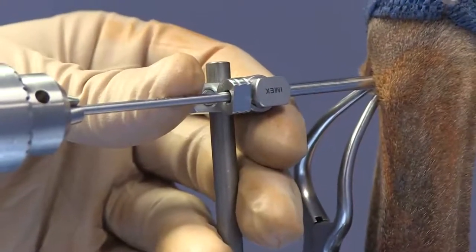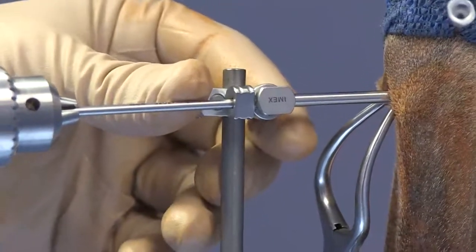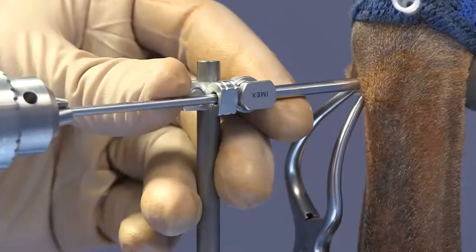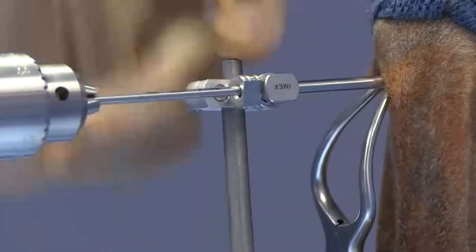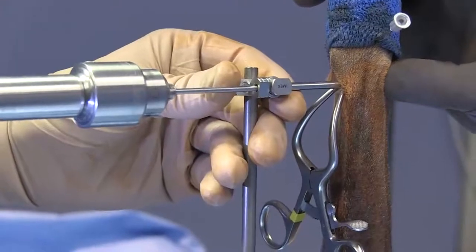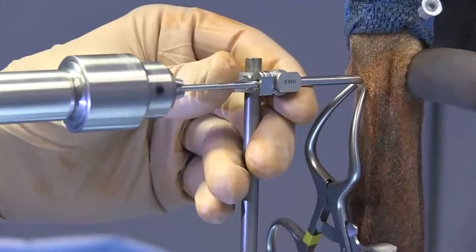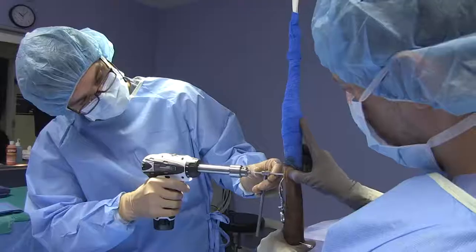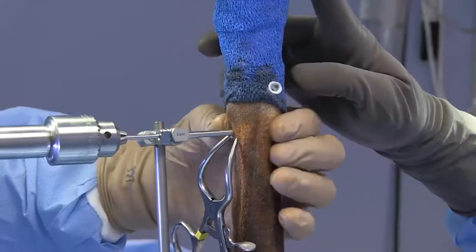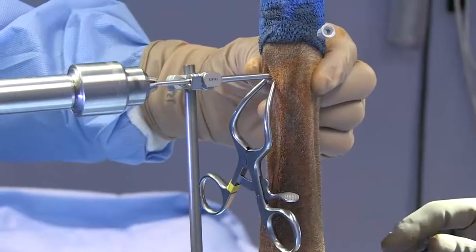Remember that the radius is kind of jelly-bean shaped, so we try to aim cranio-medial or cranio-lateral. We're putting this linear fixator on the cranio-medial aspect, angling in that general direction. After drilling, breaching the transcortex is confirmed and you can go ahead and palpate to double-check that you're all the way through.